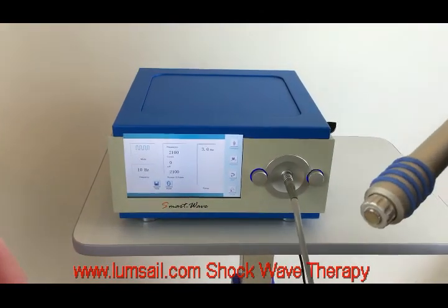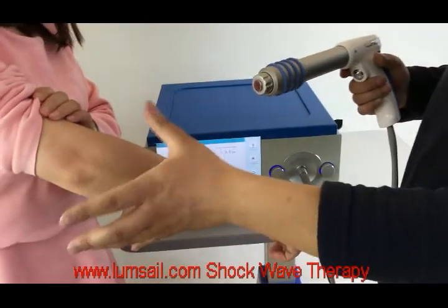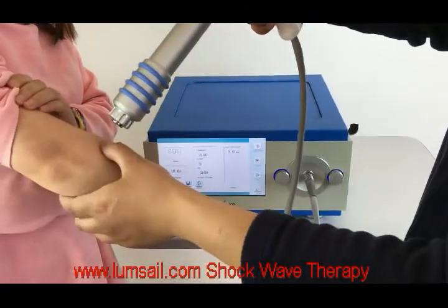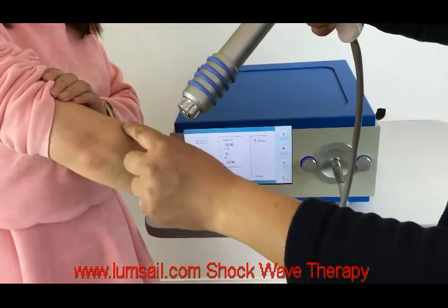Now we are starting to do the treatment. Here our patient Amy — we assume that she has some disease on the elbow. Firstly we find out the proper trigger point, for example for this area. It is a typical treatment area for the elbow — tennis elbow.